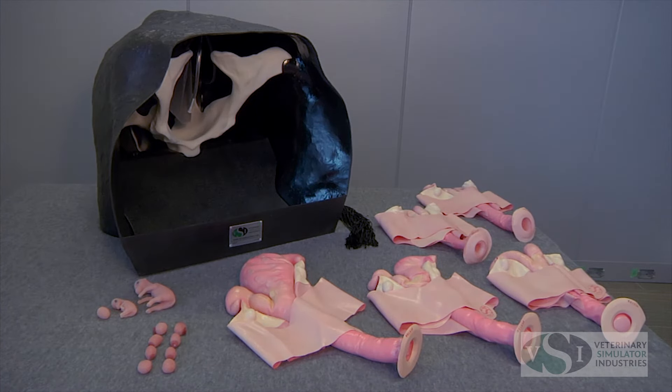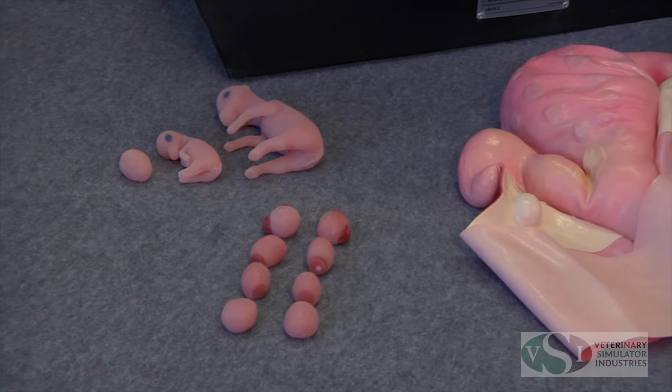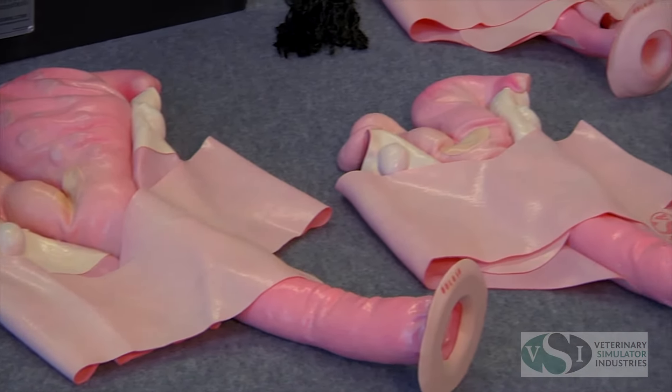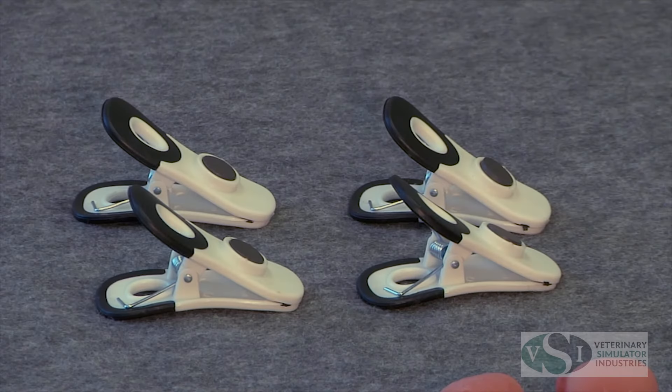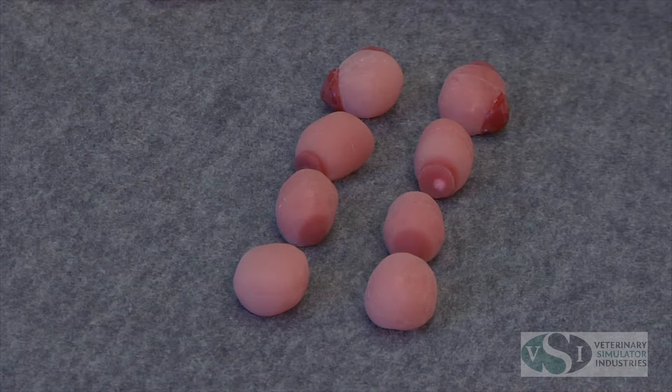Additionally, the model includes five different bovine uterus models. There are two open uterus models — the open cow and the open heifer — which can be used to demonstrate AI techniques, as well as 45-day, 60-day, and 90-day uterus models to demonstrate different stages of bovine pregnancy. The model comes with clips to secure the uterus models in place and four sets of ovaries at various stages.